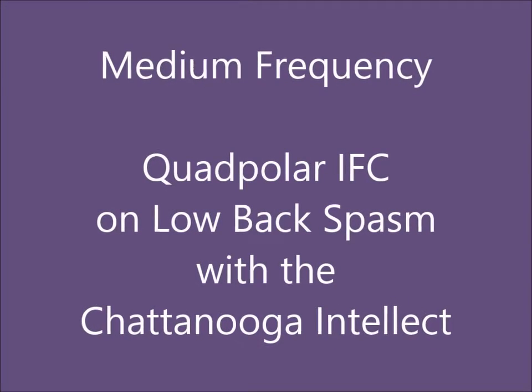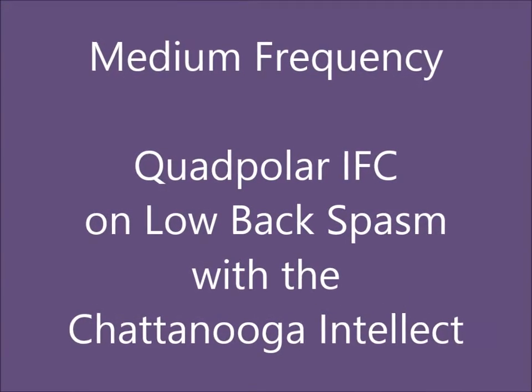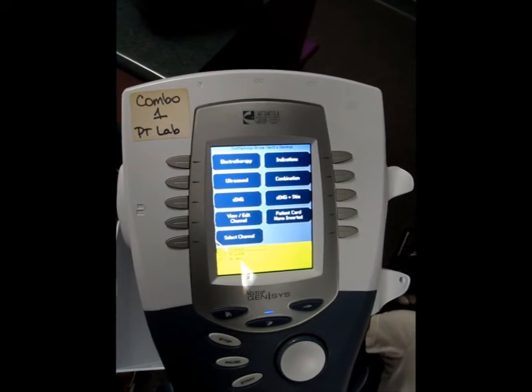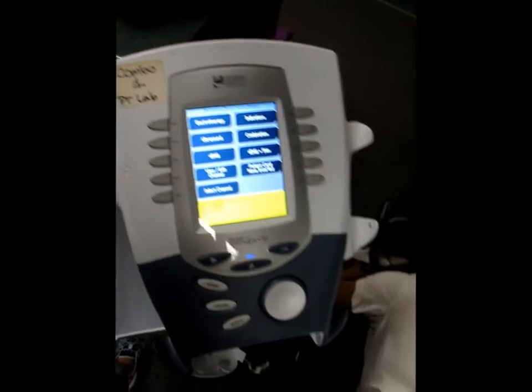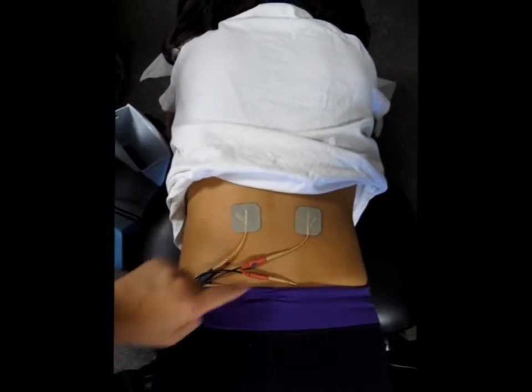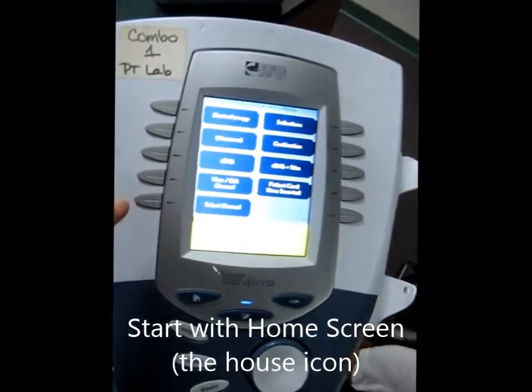Medium frequency, quadpolar interferential current on a low back spasm with the Chattanooga. This is a demonstration of using the Chattanooga unit to do a treatment on a low back. The pads have been set up in a quadpolar setup, and now I'm going to show you one more time on the machine.